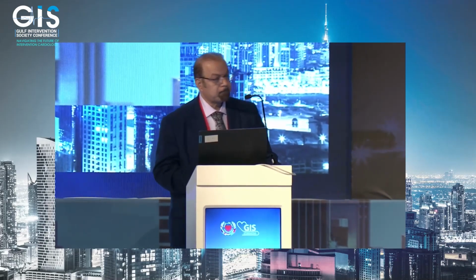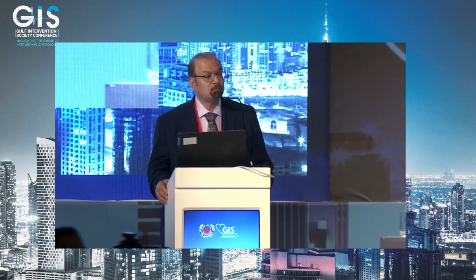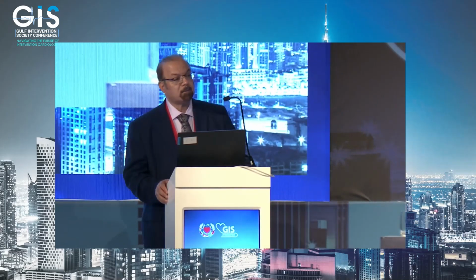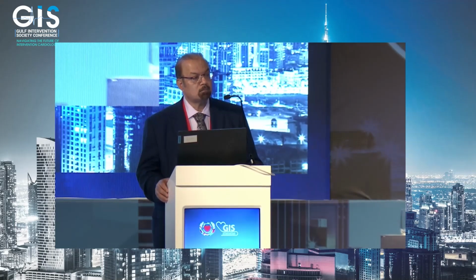Ahmed, thank you. I just have one comment, essentially for younger colleagues in the room. A common theme in those complication sessions is battling with stent delivery. Get a guide extension, use it more liberally, be more familiar with it, and inchworm it across the region. Then I think a big percentage of the complications in terms of stent loss, difficult delivery, and losing the system would essentially be aborted. So, more liberal use of guide extension.